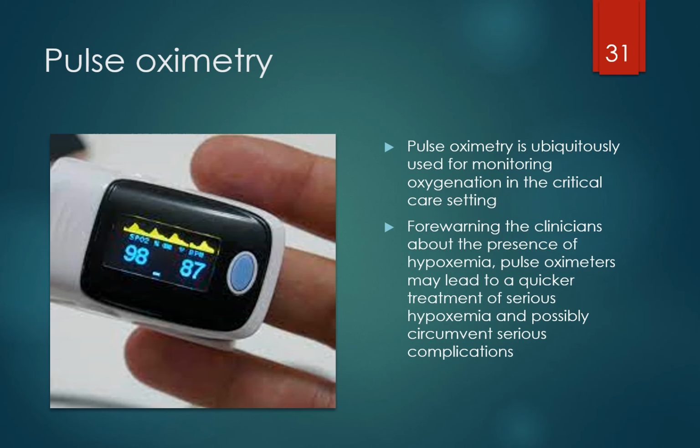As I mentioned earlier, people who get older, their pulse oximetry values will get less. So what may be normal for someone who's 25 years old may not be the same value for someone who's 75 years old. You can expect that if a 75-year-old has a pulse oximetry of 91, 92%, they're fine. So the point is this: a pulse oximetry is a non-invasive device. It's great at measuring oxygen levels, it's something you could do really handy, and you could trend it too. A lot of times they use pulse oximetry for patients at night when they go to sleep, to see if they become hypoxic during the night because of obstructive sleep apnea. So it's a very good tool to have.